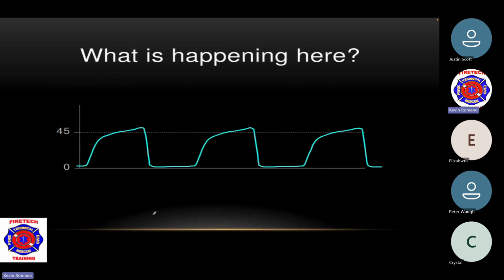So what do you think is happening here? When you look at this picture, what do you think? Right? Let's break it down a little bit too. People breathe and then they stop. Well, like a sleep apnea patient, maybe. Yeah, not necessarily sleep apnea. What are you seeing here? Is that normal? Does it come up like this and then plateau off? Or is that rounded? Yeah, rounded.